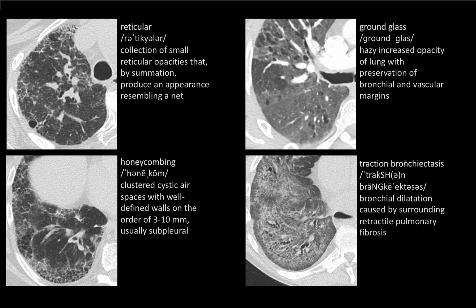I put the definitions of them right below, and I got these definitions from the Fleischner Glossary, which if you haven't read it, you really should read it, especially if you're reading CTs at all. Let's talk about the first one, ground glass opacity.